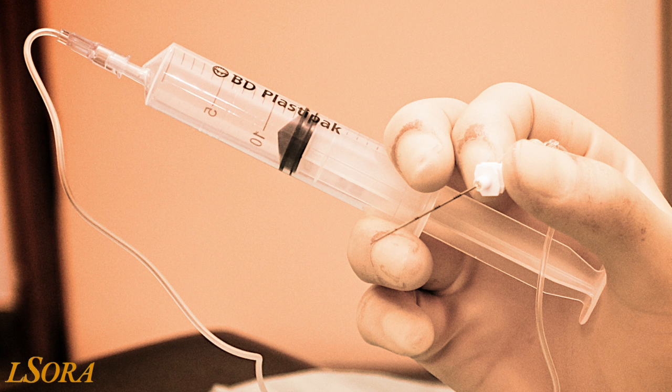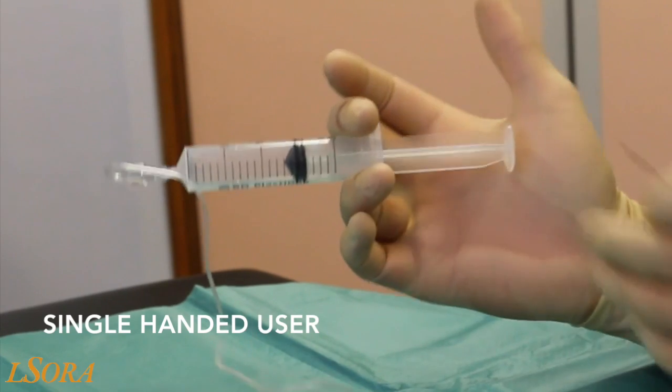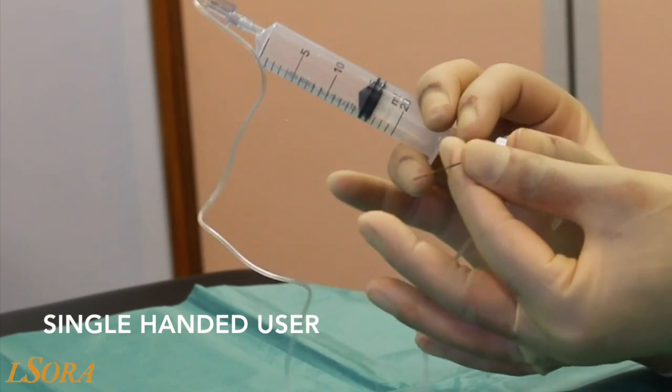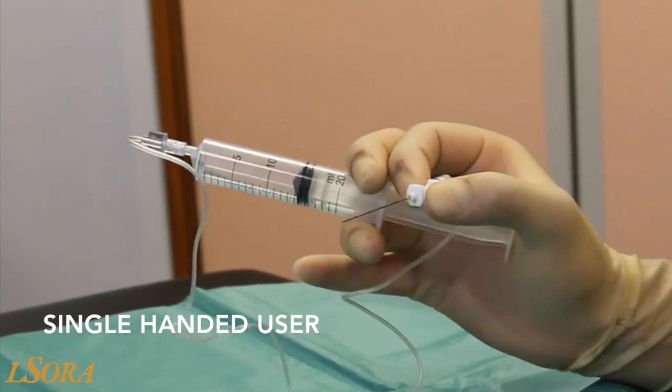The final technique, the single-handed user grip, has been published by Dr. Nigel Bedfuth et al. from Nottingham University Hospital, Nottingham, UK. With this final technique, the syringe is placed beveled facing away from the palm, between the middle and the ring finger. The plunger is rested on the thenar eminence, and a pincer grip is utilised between the thumb and the index finger.